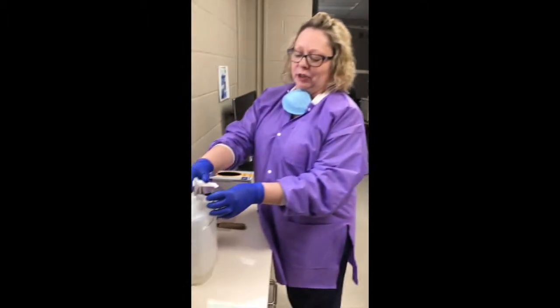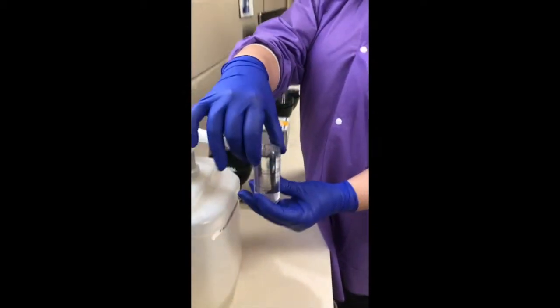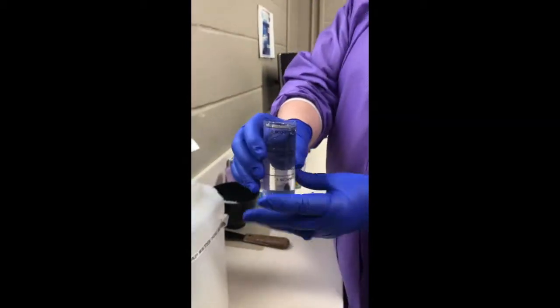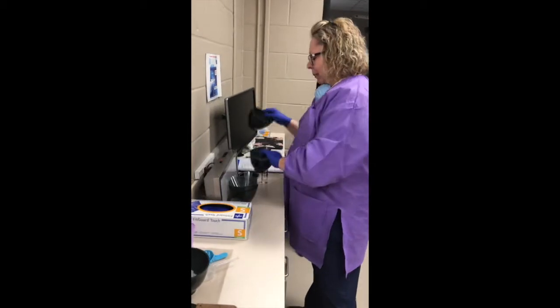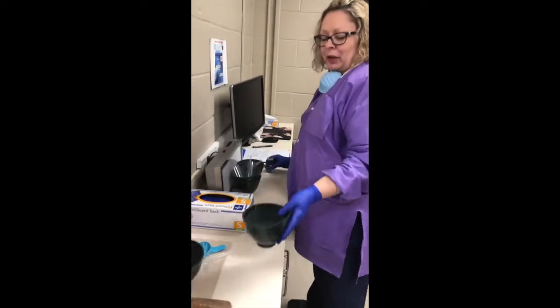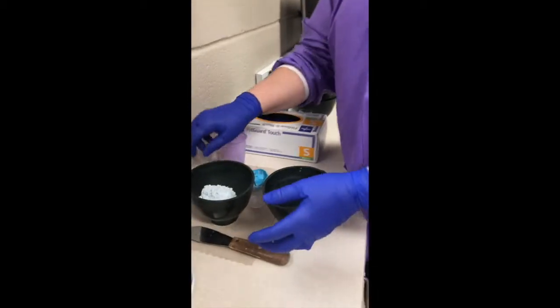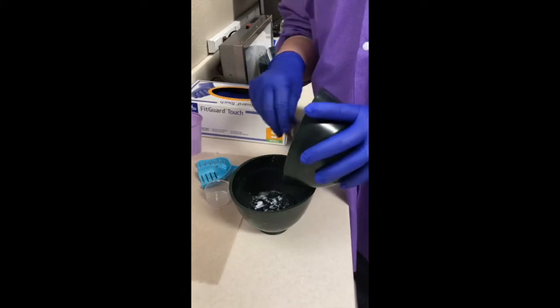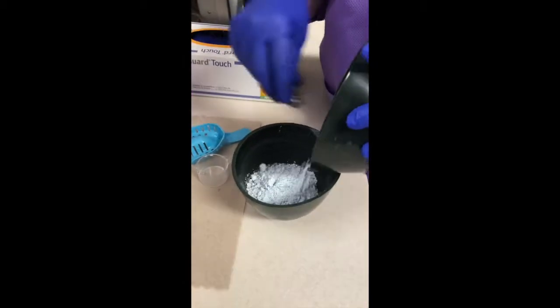So since I have 3 scoops of powder, we're going to use 3 units of water. I had actually filled this up just a little bit prior to starting filming, so I didn't have to pump it for so long. So since I've already had my powder in the bowl, I'm going to grab another bowl and just put the water in this first, and then we're going to slowly add the powder. Very slow with it.